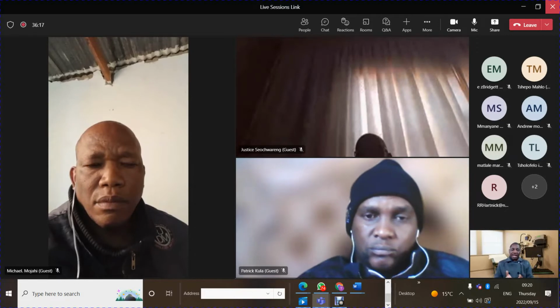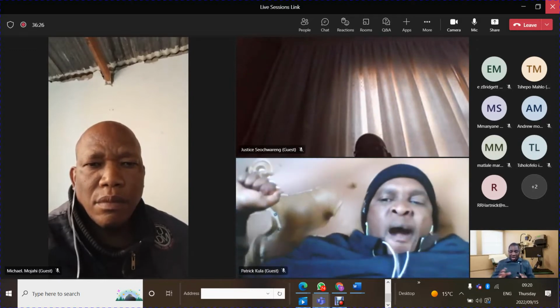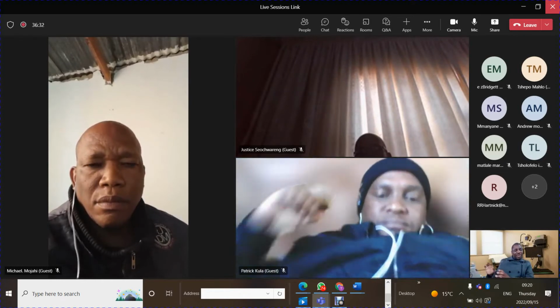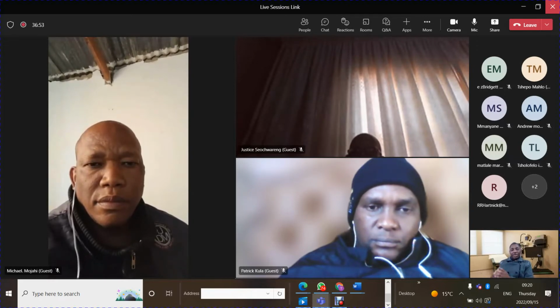And then it takes that output. Remember, there's a code written at the back. There's software that does all the processing of the signal before it converts that. So we have the signal processing part. Coming from the probe, that signal needs first to be amplified, if you understand how the instrument system works. You pick it up from the probe, it's amplified so that it can be easily read, and then it's processed through the signal processing. That's where the software and algorithm converts that into a form that can be read and displayed.